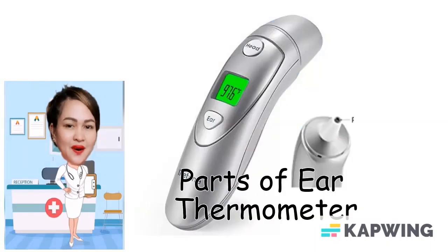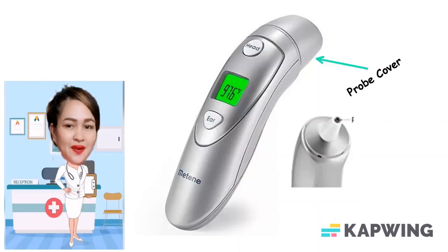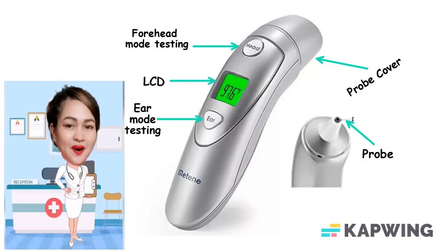These are the parts of the digital ear thermometer: the probe cover, probe, forehead mode testing, LCD display screen, ear mode testing, and the battery cover.